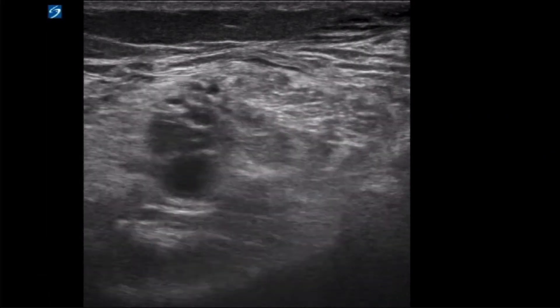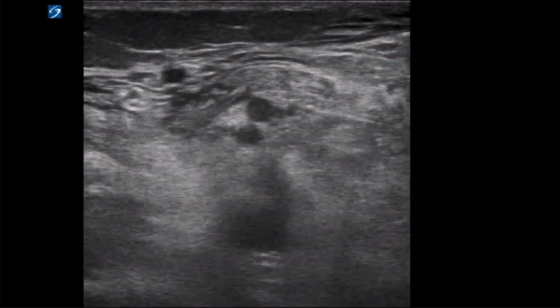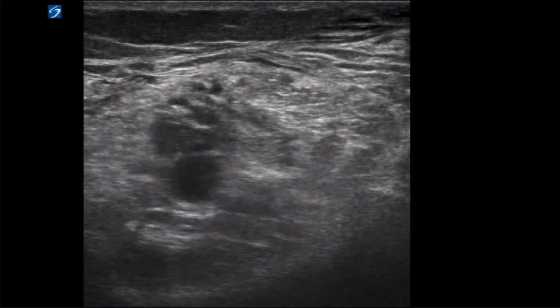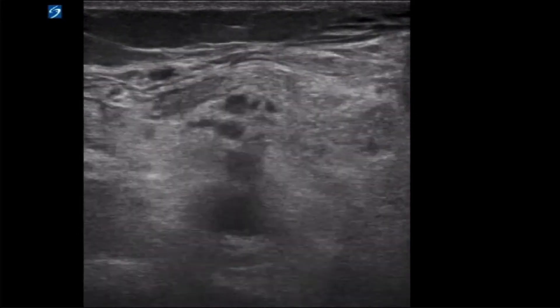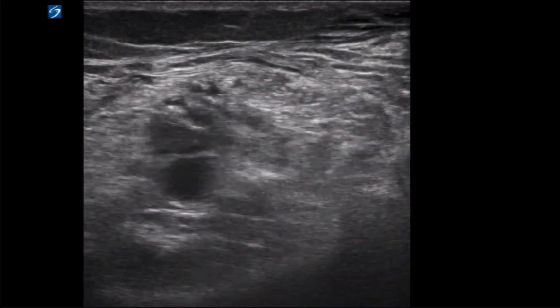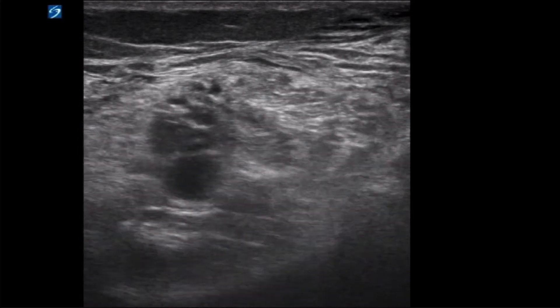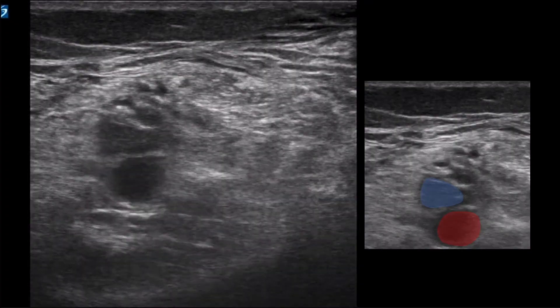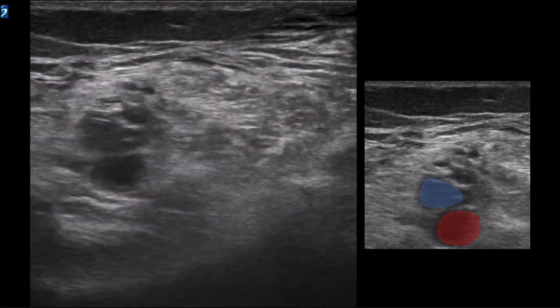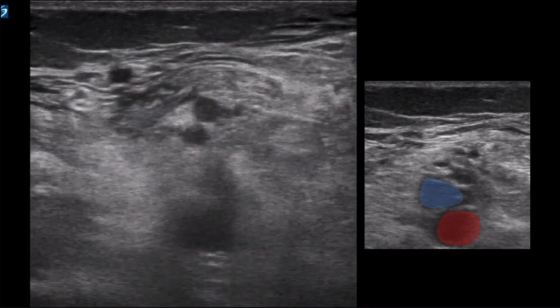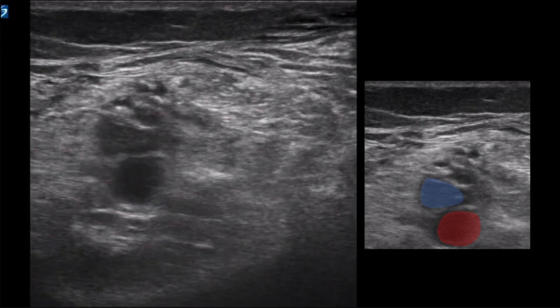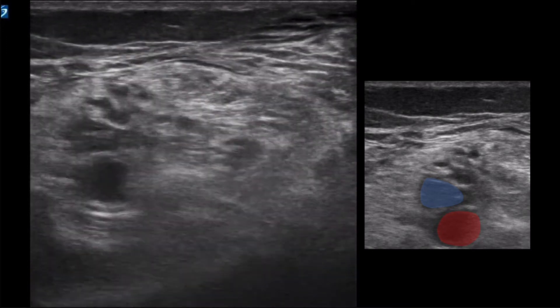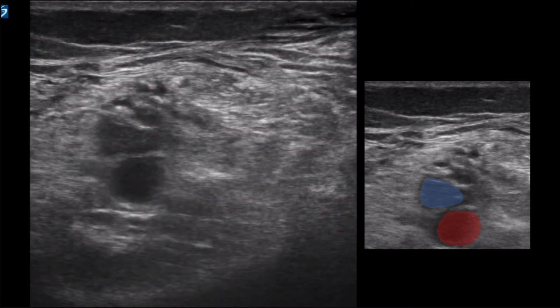After the proximal leg was scanned, the next step for a point-of-care study is to evaluate the popliteal vein. With this clip recorded in the region of the popliteal fossa, the most important structure to initially identify is the popliteal artery. The popliteal vein lies superficially to the artery, and in this image is found to be non-compressible. The popliteal vein trifurcates distally, and for added sensitivity, I always attempt to follow the popliteal vein into the trifurcation of the anterior tibial, posterior tibial, and peroneal veins, given the branch point concept of turbulent flow.